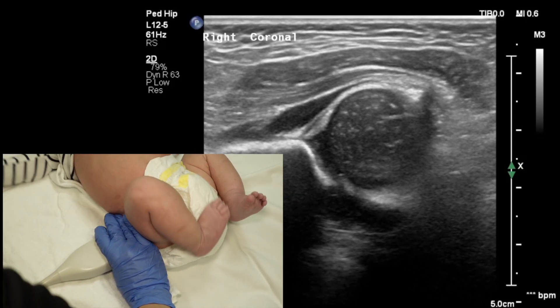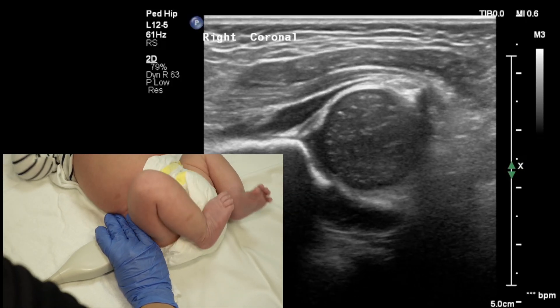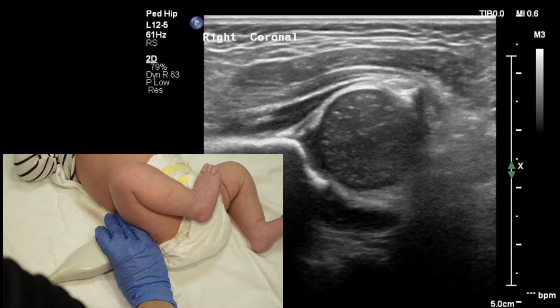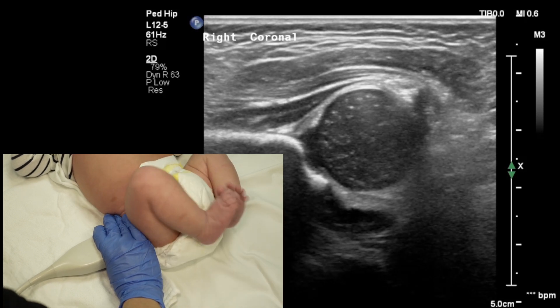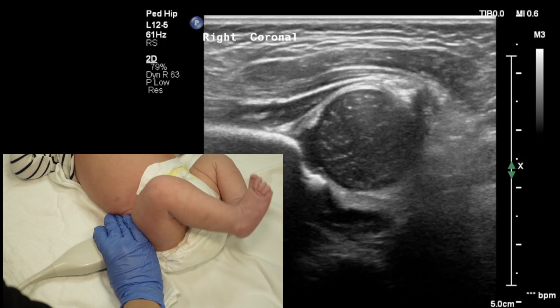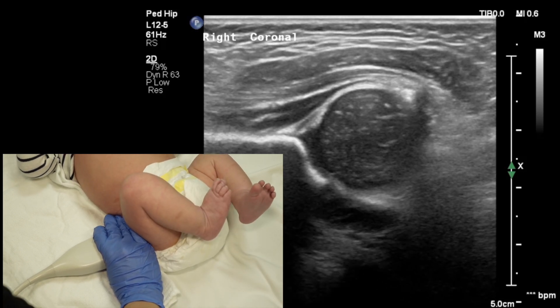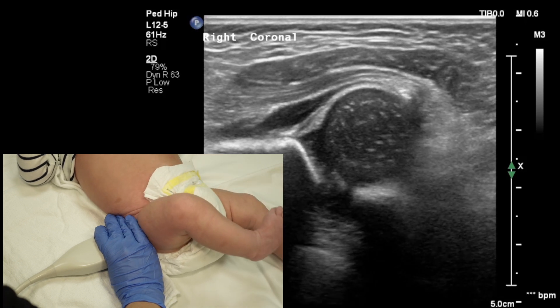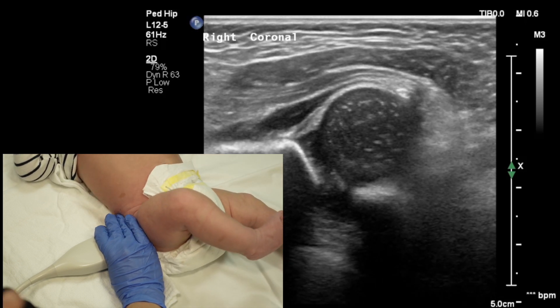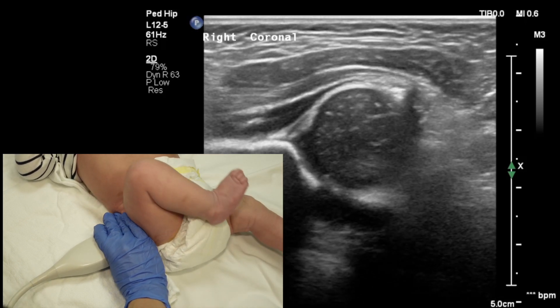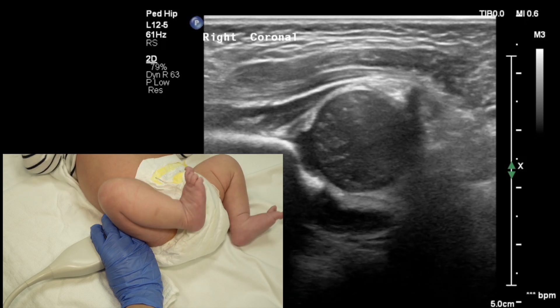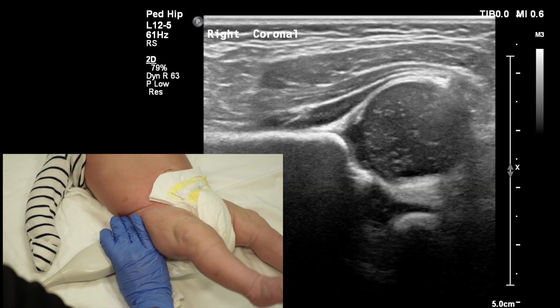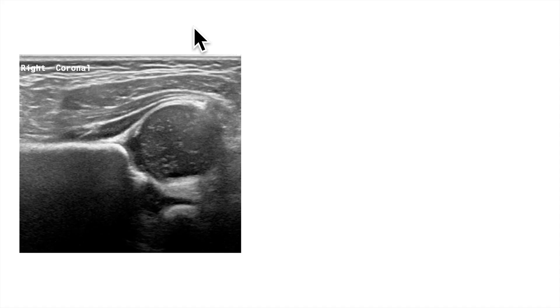This is how coronal images are obtained. Note the position of the probe — it's somewhat posterior — and the femurs are freely moving as the sonographer obtains images, sometimes cine clips, going anterior to posterior. And here is the still image where measurements are going to be made.